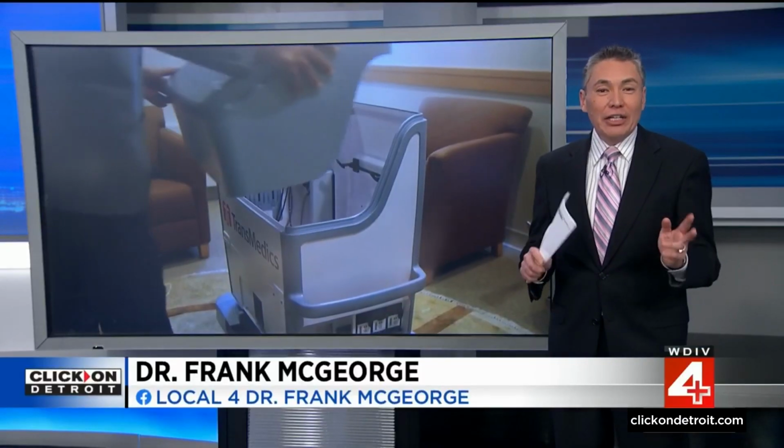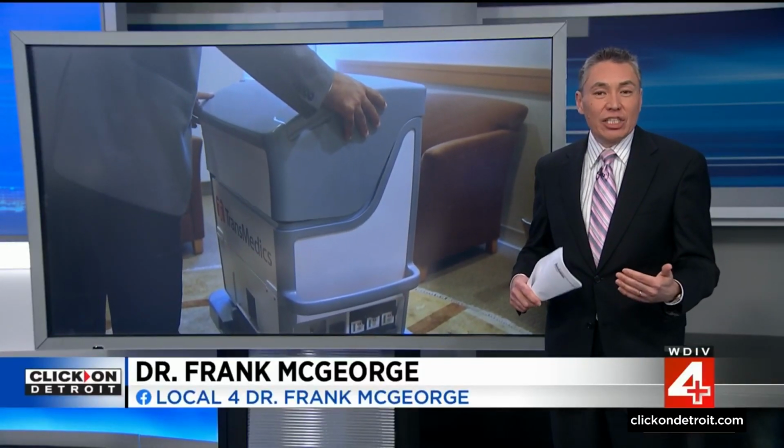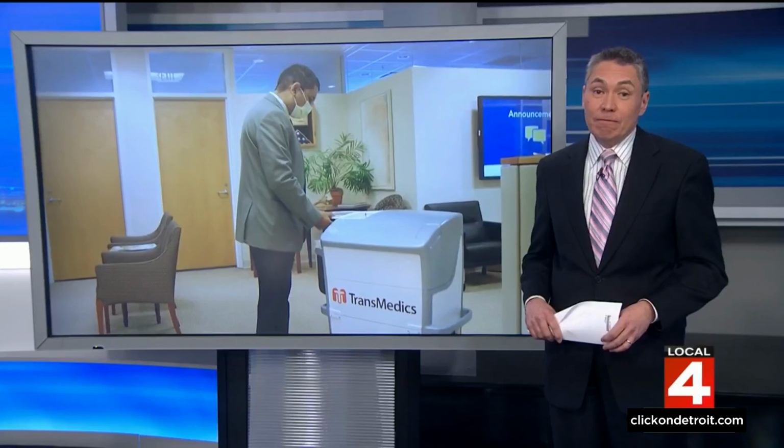It sure does, Pam and Karen. Actually, the system is called Heart in a Box, and it increases the access to donated hearts by significantly extending the amount of time that a heart can be preserved outside of the body, which basically increases the distance that it can be transported to those patients in need.